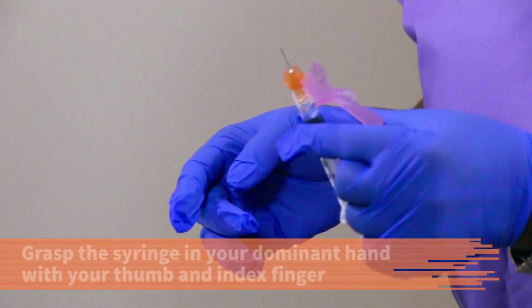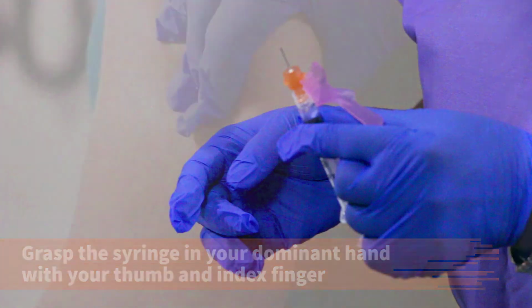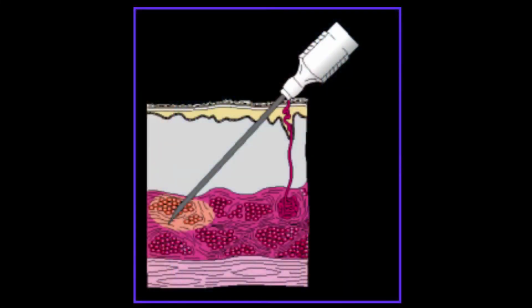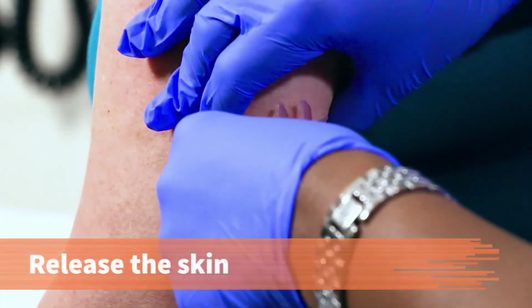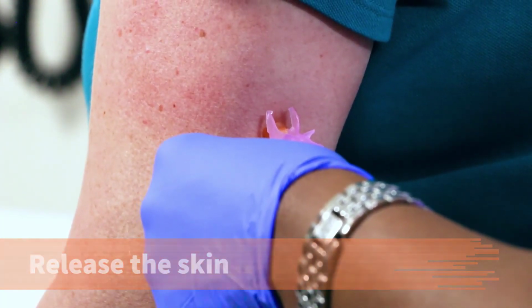Grasp the syringe in your dominant hand. Use your thumb and index finger. Make sure to have no fingers under the syringe. Quickly and smoothly insert the needle into the site using a 45 or 90-degree angle, depending on the needle size. Insert the entire needle. Make sure the needle tip is not pointed towards your non-dominant hand to lessen the needle stick risk. After the needle has been completely inserted into the skin, release the skin that you are grasping.